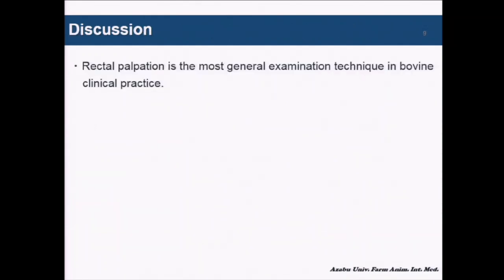So in the discussion, rectal palpation is the most general examination technique in bovine clinical practice because the ovary can be held in mere seconds.